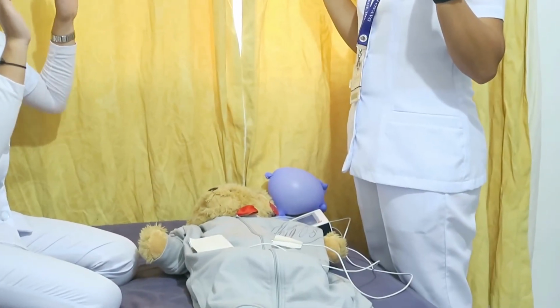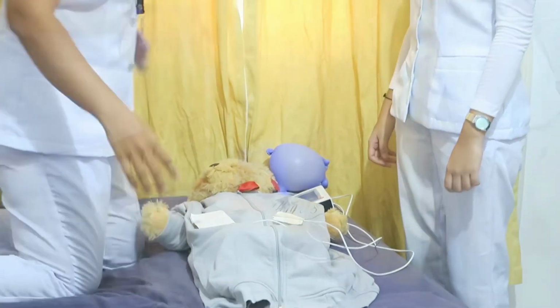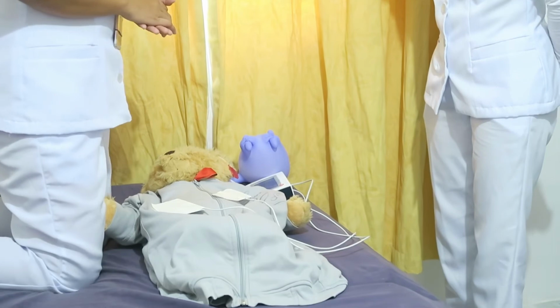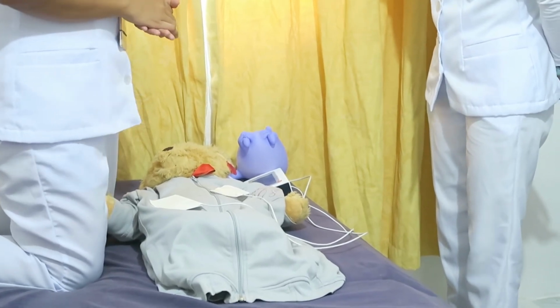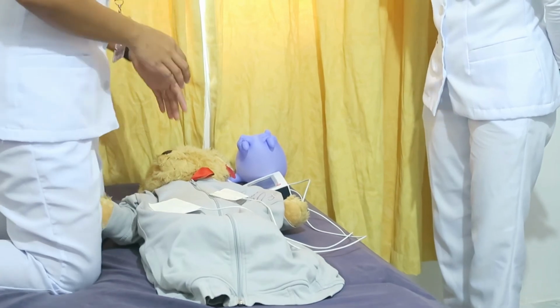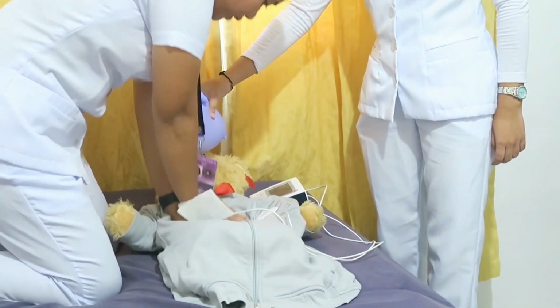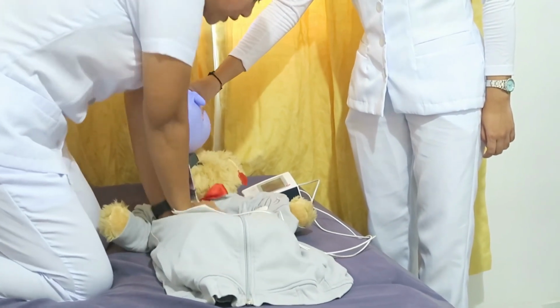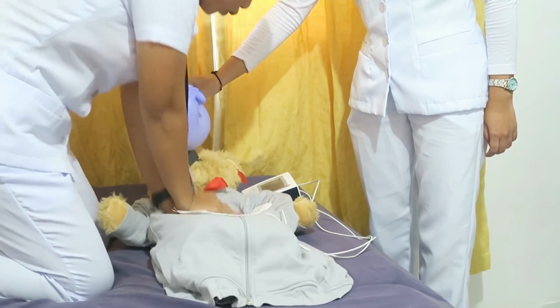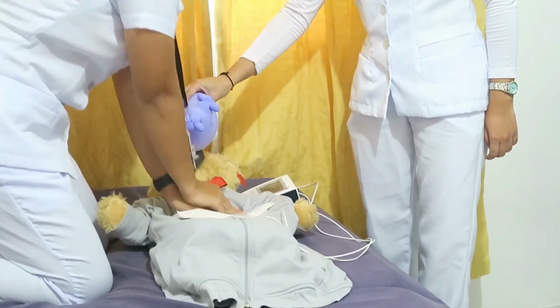Let's switch roles now. Okay. As the healthcare providers switch roles, the second rescuer continues CPR and the first rescuer gives rescue breaths with the use of a bag mask device. So, 1, 2, 3, 4, 5, 6, 7, 8, 9, 10. 1, 2, 3, 4, 5, 6, 7, 8, 9, 20. 1, 2, 3, 4, 5, 6, 7, 8, 9, 30.